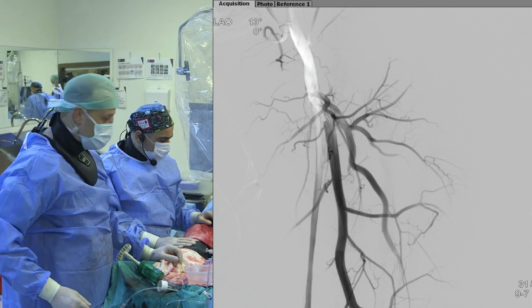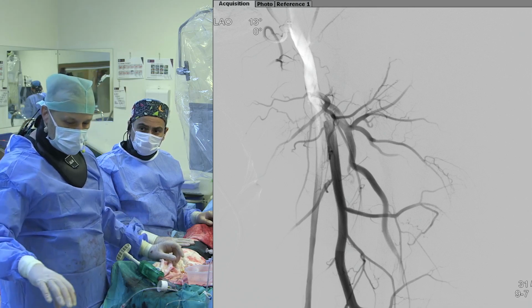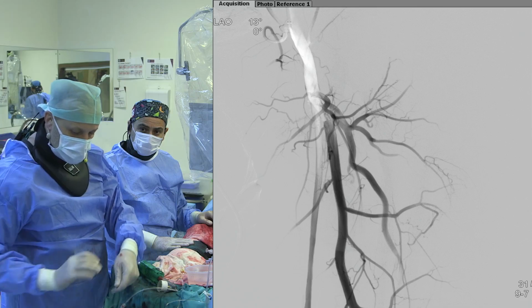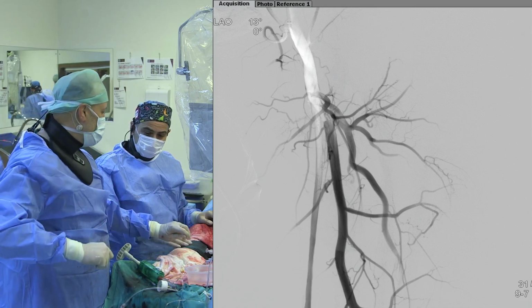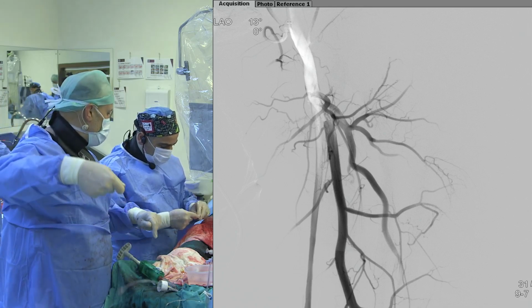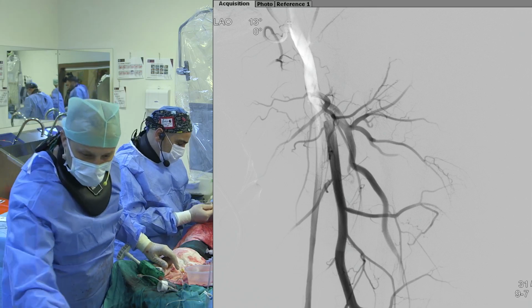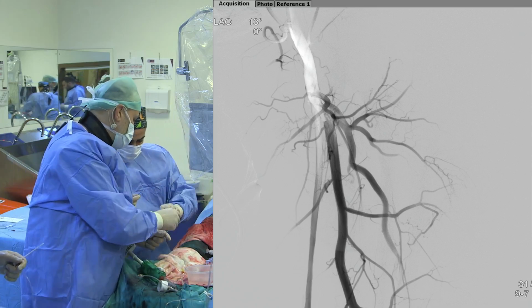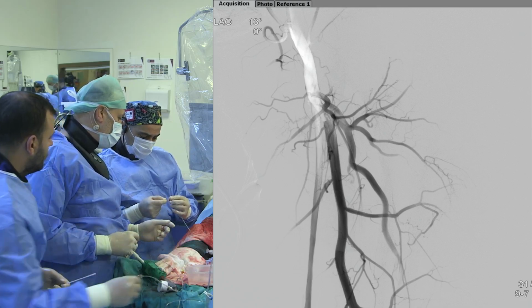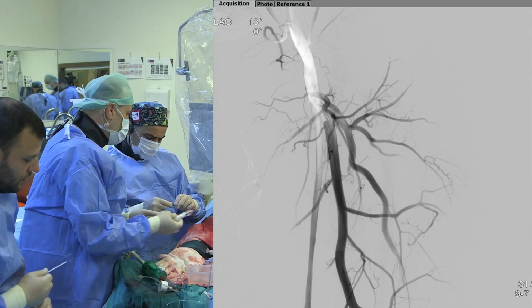Now, we were not sure about the distal architecture. Then we concluded that we were in a collateral artery. Dr. Ahmet has requested distal architecture of the arteries on the foot.